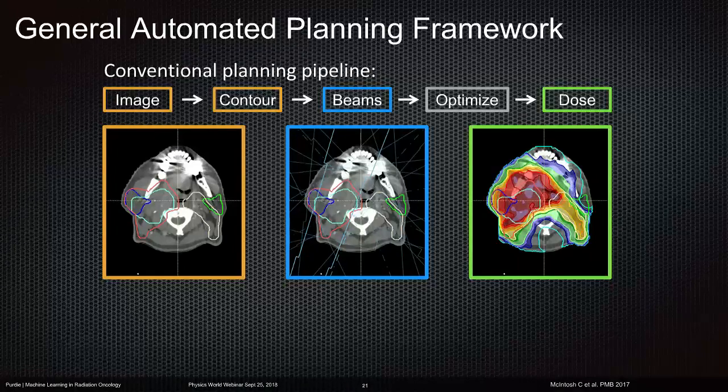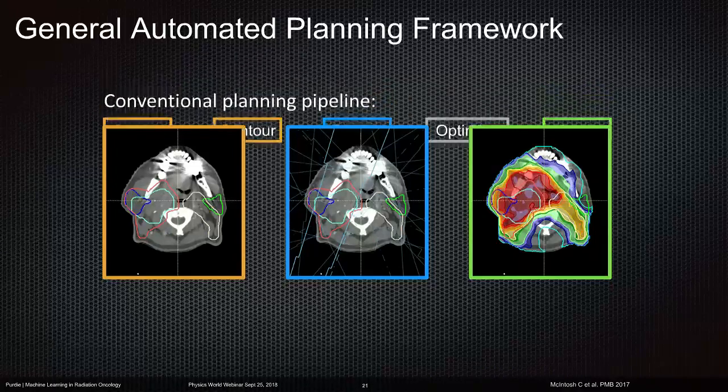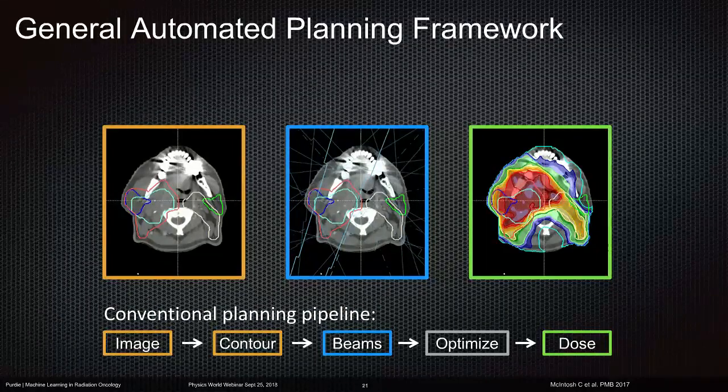So here's a 10-second primer on treatment planning in radiotherapy. We image, contour, we add beams, we go through this iterative optimization process, and we then calculate a dose, and then we iterate and iterate. What we decided to do was change this paradigm with machine learning because, in effect, we know exactly what the dose distribution is that we want to see, but there's really no nice way in any software to articulate that, aside from, if you had a paintbrush, you could start painting dose on a plan, which would take forever, but would also be highly inaccurate.